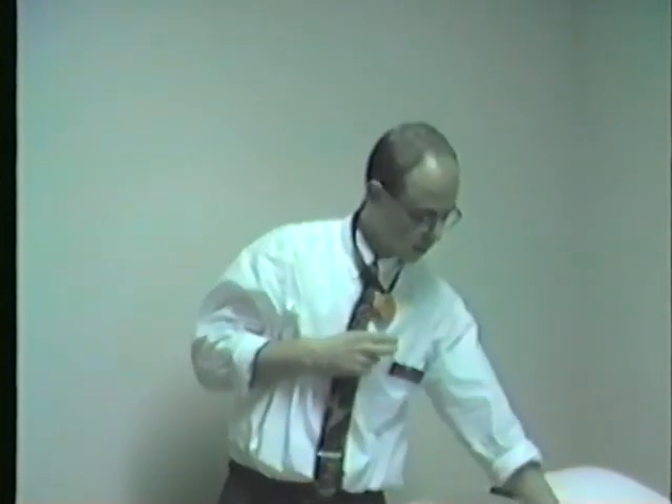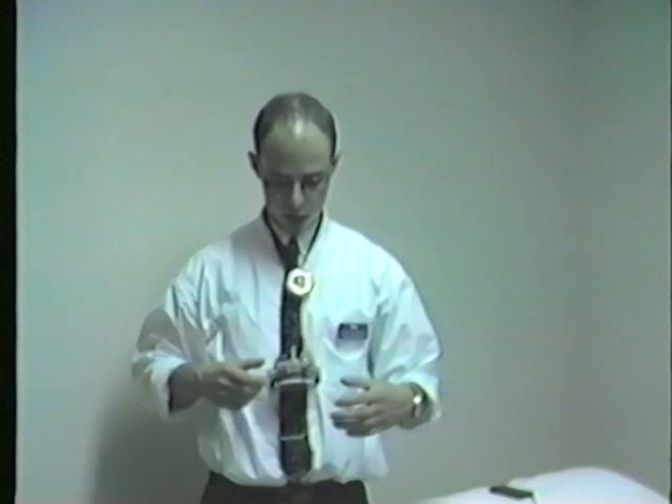Here's how the therapist will prepare for measurement. First, the suspension device is attached around the neck. Next, the tool is attached to the suspension device. Now it depends on at which level of the body the therapist wants to measure — I can pull it to that desired level and just leave it there, or bring it back higher up if needed. I have my hands free for patient safety or to record some data. And once I'm at the level that I want, I will just free the inclinometer and I'm ready to measure.